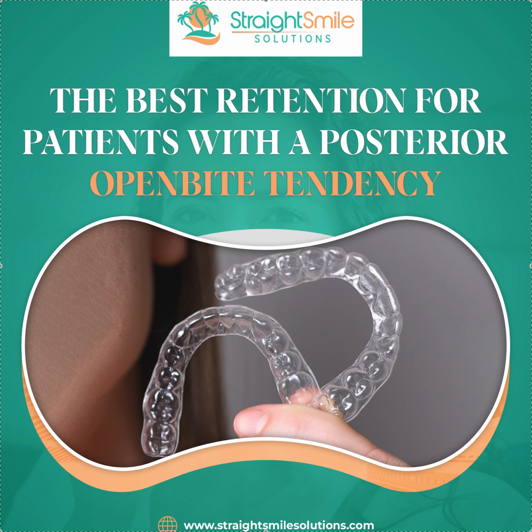Definitely a few things that I've been saying all this time do cause that. I actually had told a client this yesterday, this exact same conversation twice in 24 hours. We were talking about what makes it happen. I said, well, it didn't happen when we wore bonded retainers and Hawleys. So the only reason it's happening is because there's plastic on the teeth. And we all know it can happen during aligner treatment. Retainers are thicker than aligners.